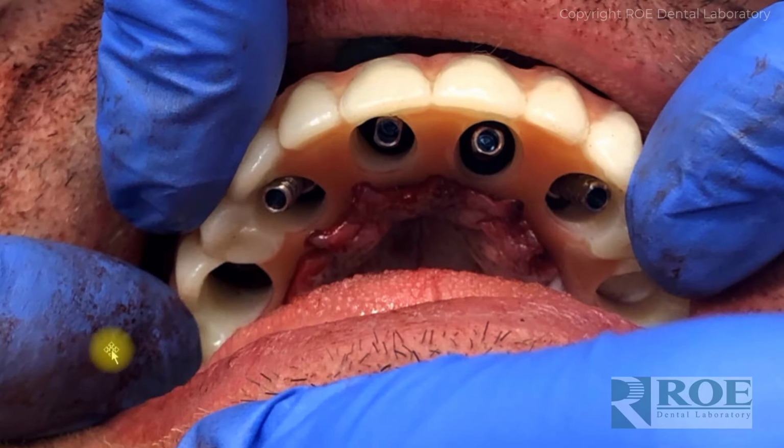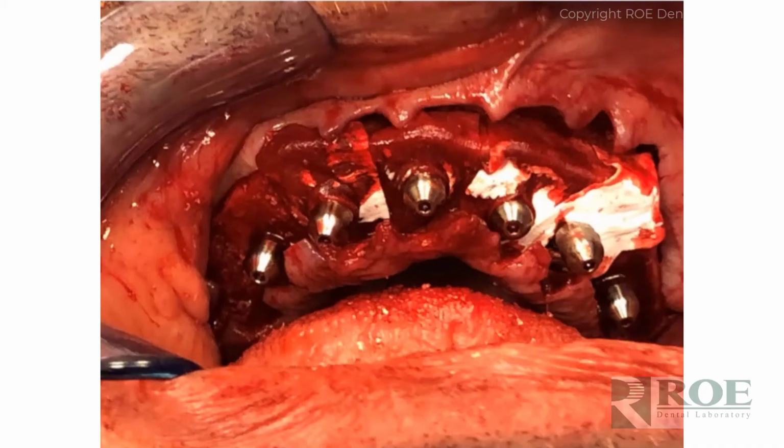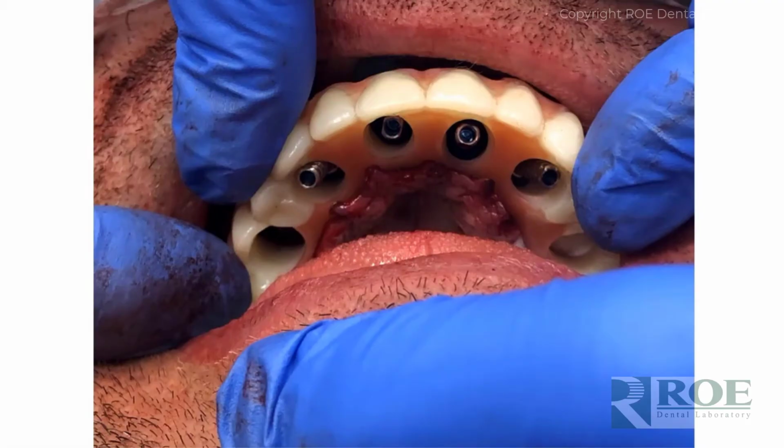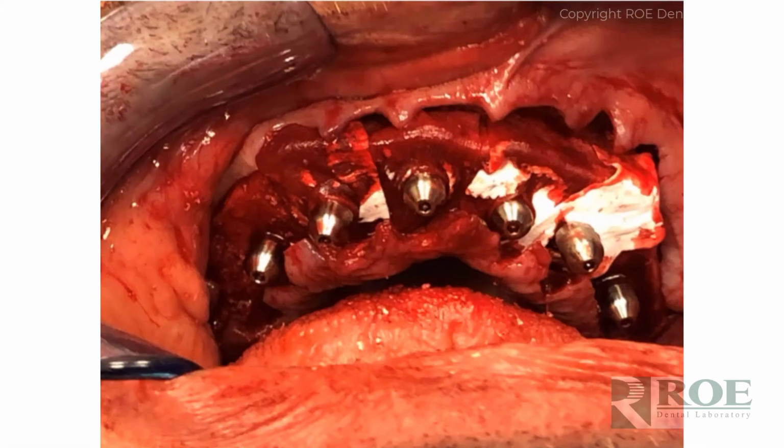And then the next step is to just simply backfill this to connect the prosthetic to the temporary cylinders. Of course, don't forget to put the block-out gaskets in and the blue plugs. And again, you can see that in a lot of detail in many of our videos, most of our videos. Then once you've picked up both the rapid appliance and you've picked up the prosthetic, then CHROME can be removed.